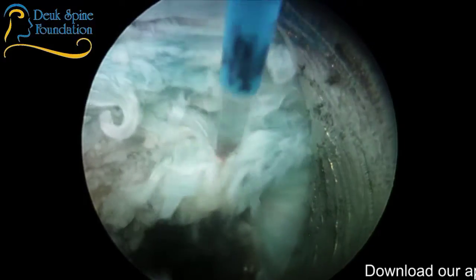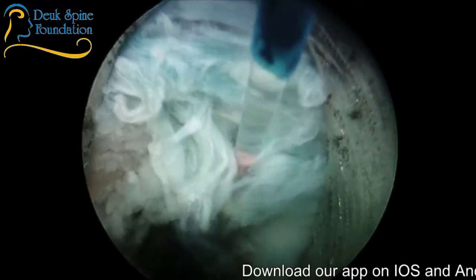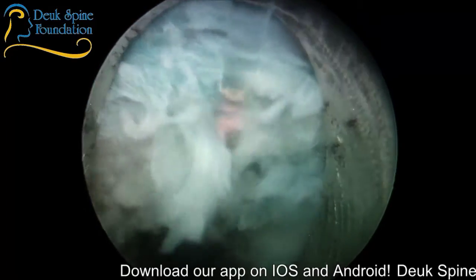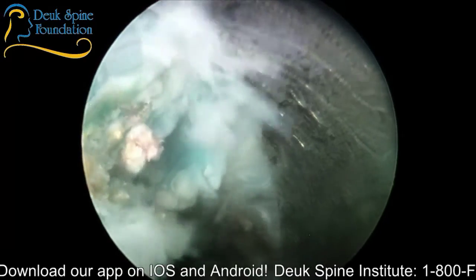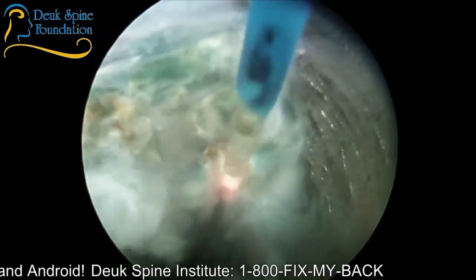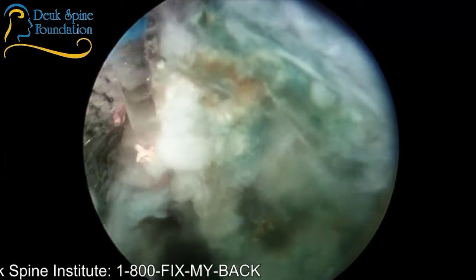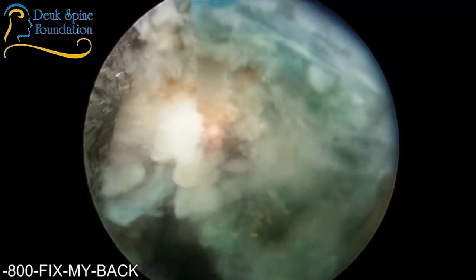So here's the annular tear. You can see it in all its glory. It just looks all jacked up, right? You can see the fibers right here, kind of in the middle of the screen, where they used to connect with the other side. And just so you understand, in the Deuk laser disc repair procedure, I actually go through the annular tear with the instrument. So I'm not actually doing any damage to the disc by going into the disc. I'm just passing through what's already torn, what's already damaged, which is perfect because I'm in exactly the right spot to repair it. So this is really an incredible surgery.